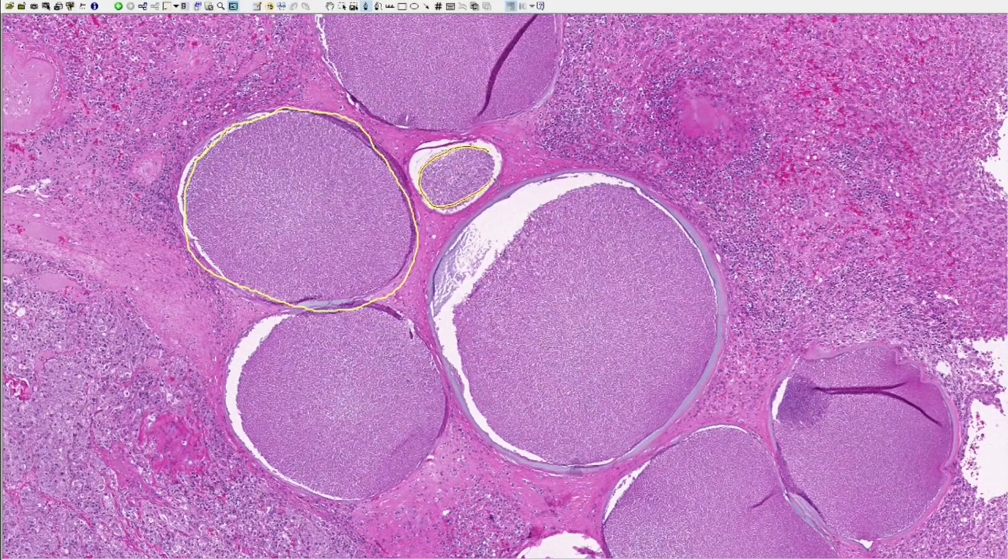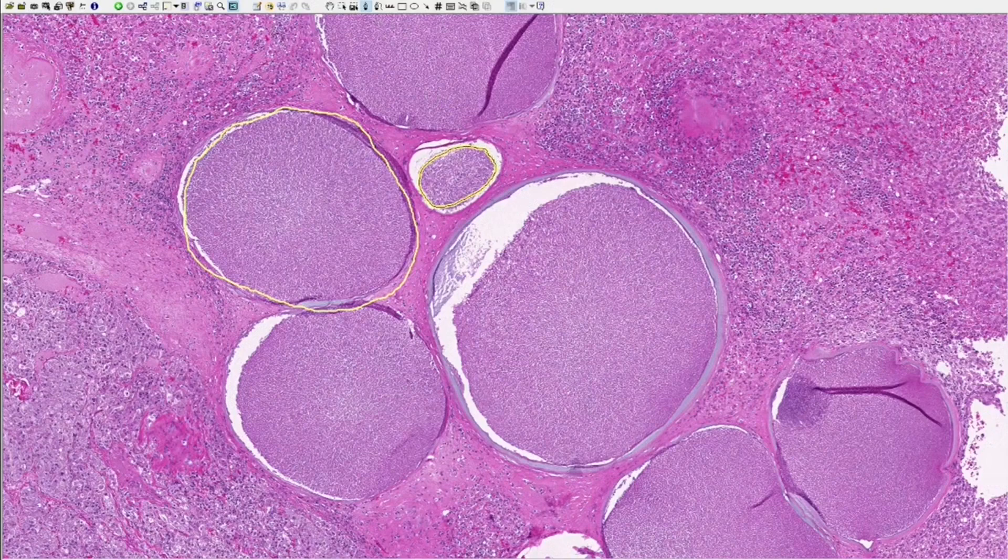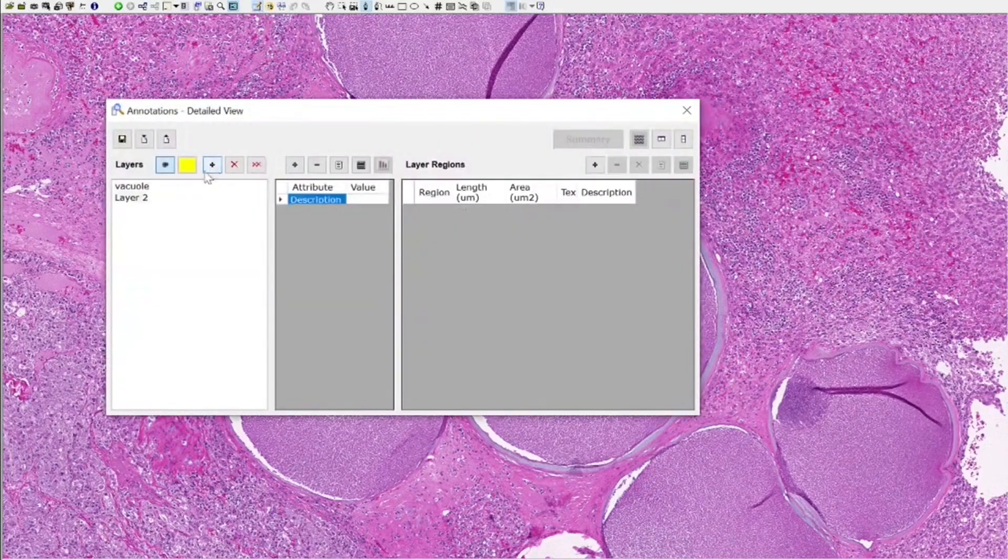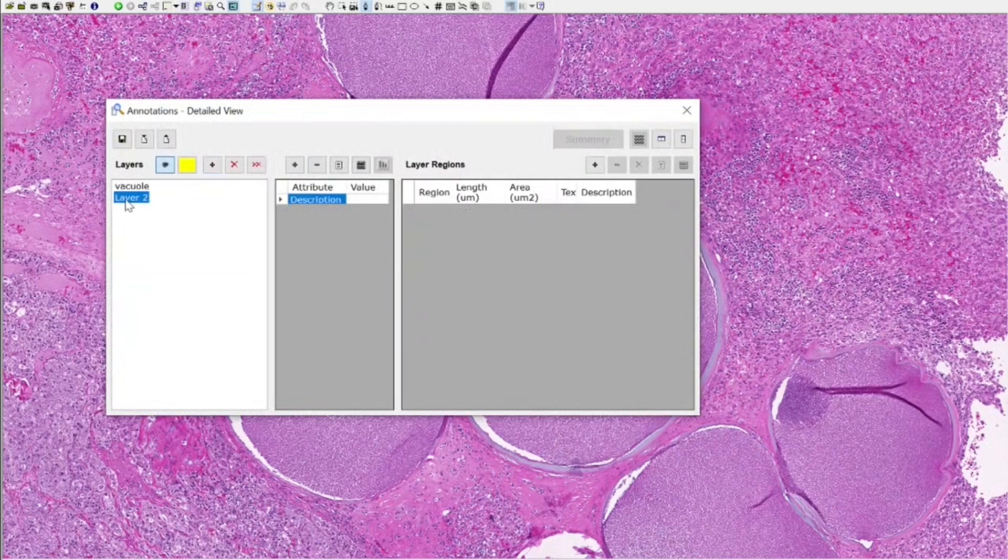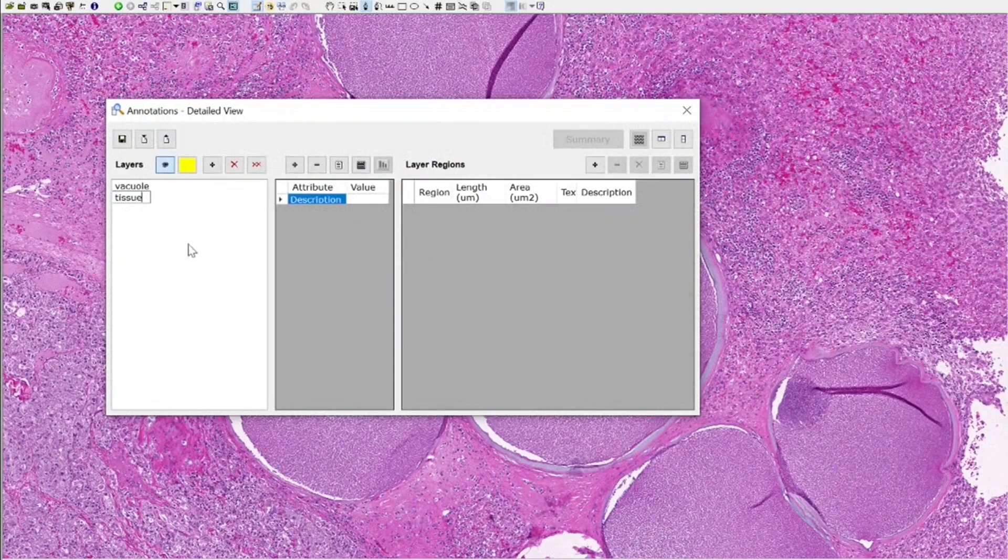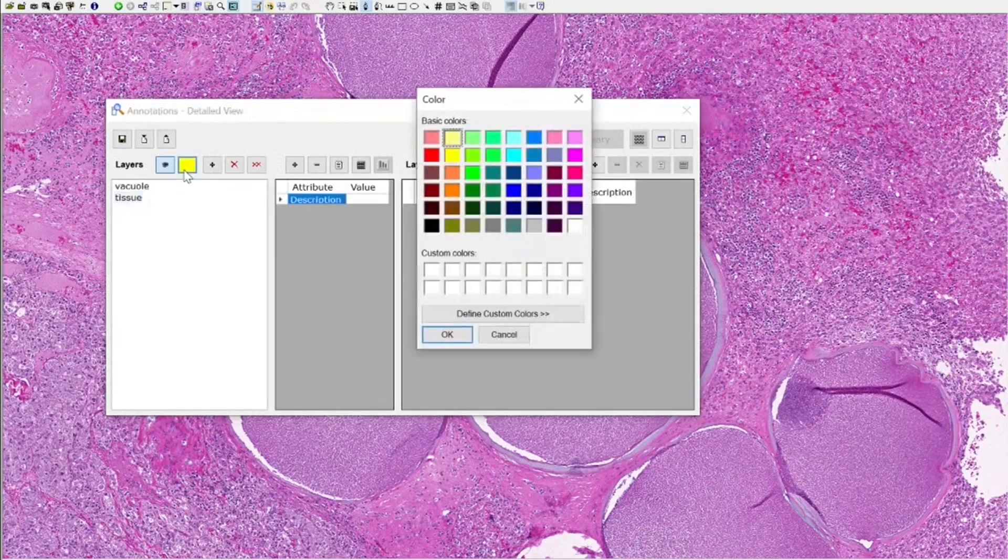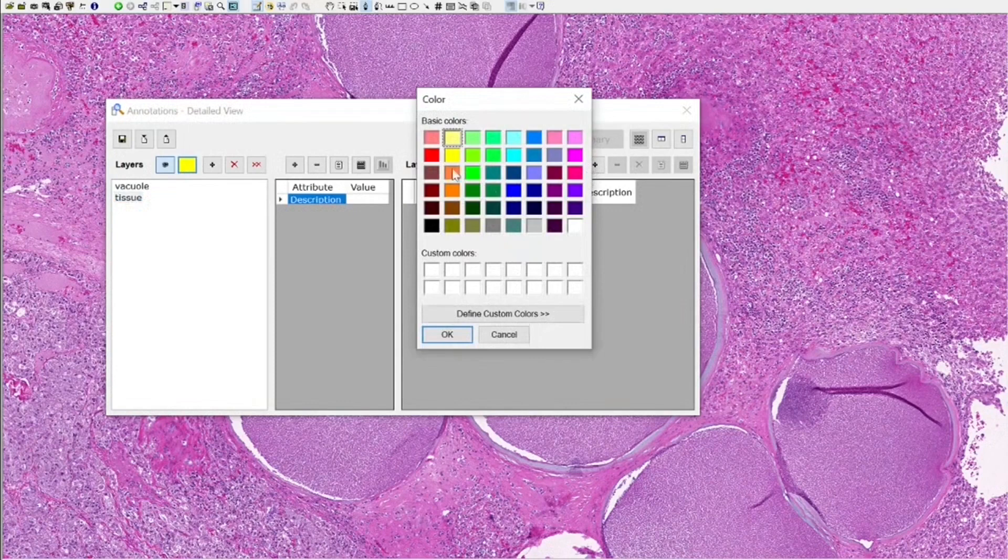If we want to, we can add another class by clicking this plus button. I want to just add a class called tissue. Vacuoles yellow, tissue. I'm going to change the color, I'm going to change it to red.